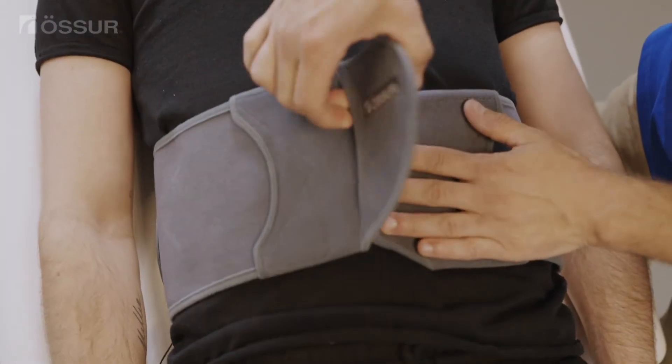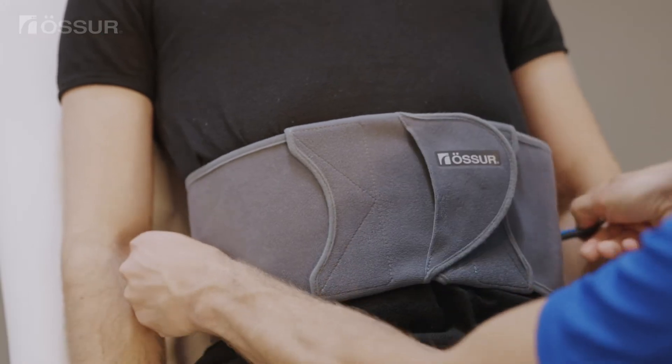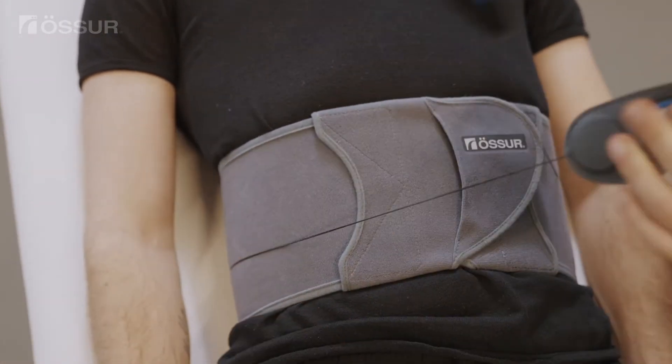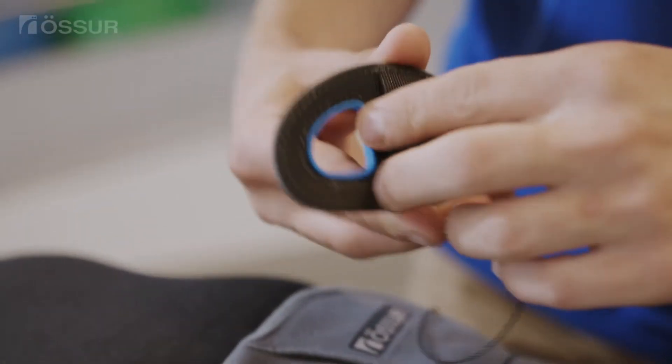Close the belt. Slide fingers through the holes in the two compression system handles and pull until the belt is at the appropriate tightness. If necessary, adjust the compression system cord length.